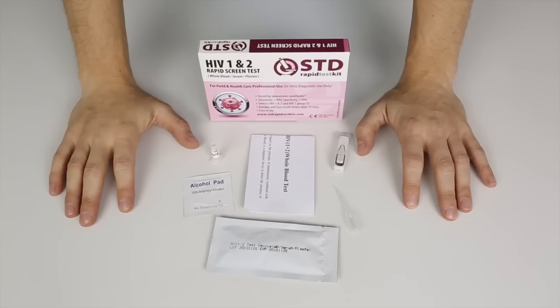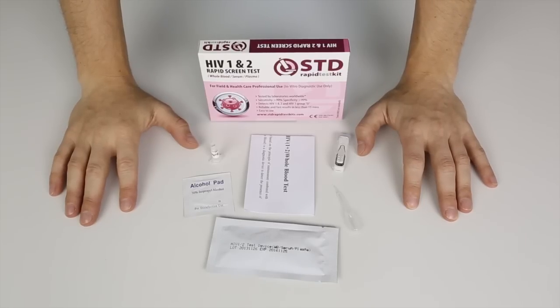Hello everyone and welcome to the HIV rapid home testing tutorial. We're now going to show you and demonstrate how the HIV one and two rapid home screen test works.